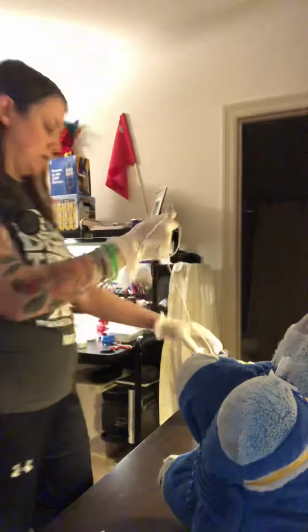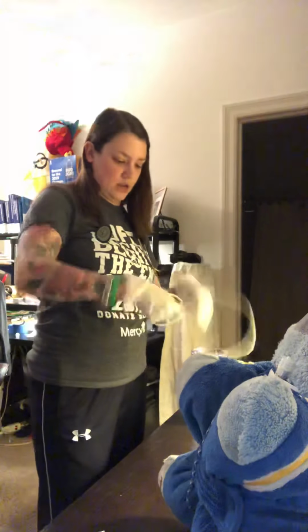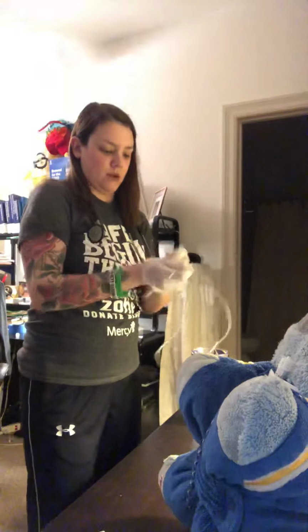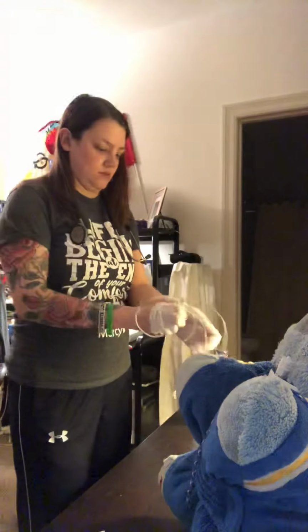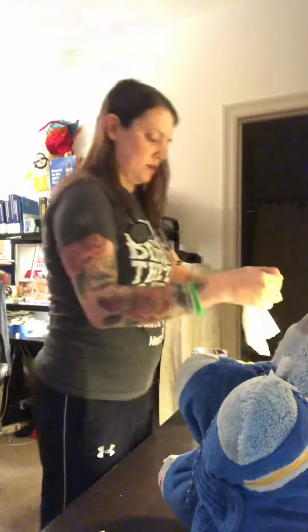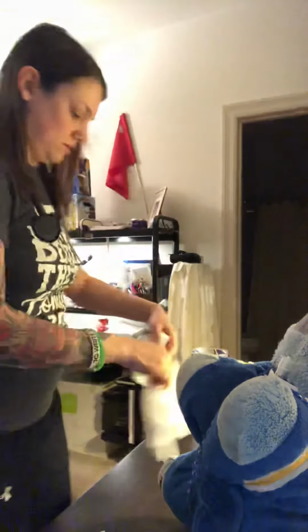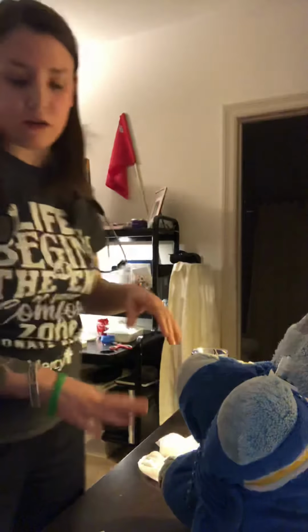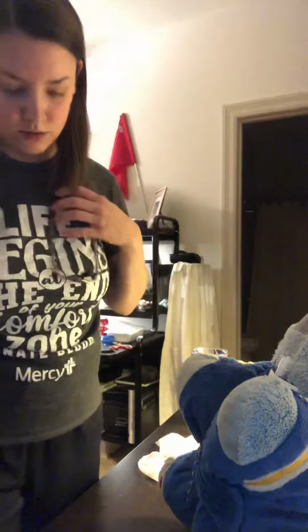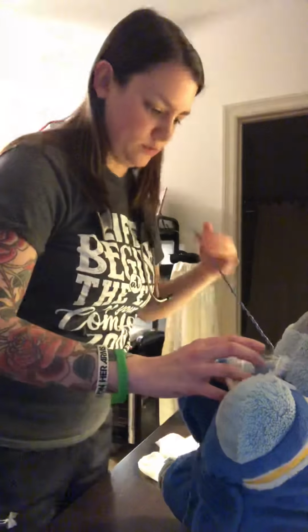So now I'm pretty much finished, so I'll go ahead and disconnect this here. And then I would take my gloves off and throw that away into the proper trash receptacle. Okay, I'm going to keep these gloves. I would not reuse them, but I'm going to go ahead and use them again since I don't have another pair. Oh, I have to put this back on.